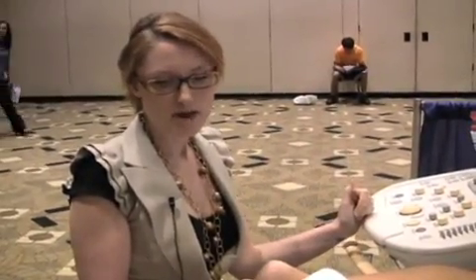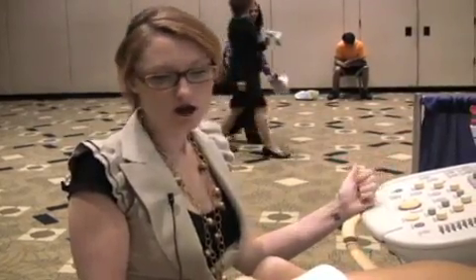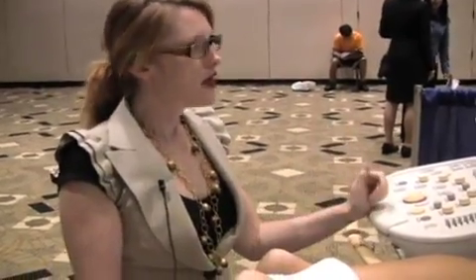I'm just going to cover the major structures and the major things that can potentially go wrong in the foot and ankle. But again, like at all areas of ultrasound, you need to expand your study according to patient symptoms. So that's really important to be aware of. So we'll start with the plantar aspect.